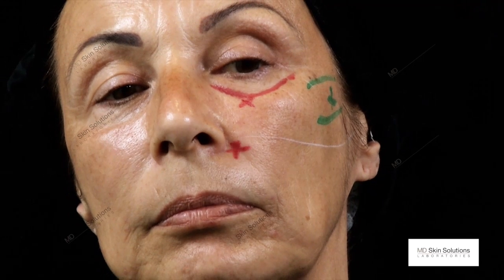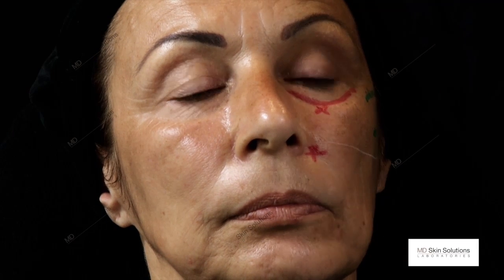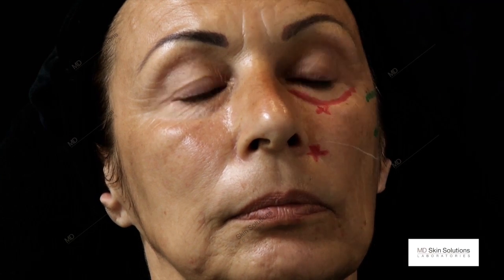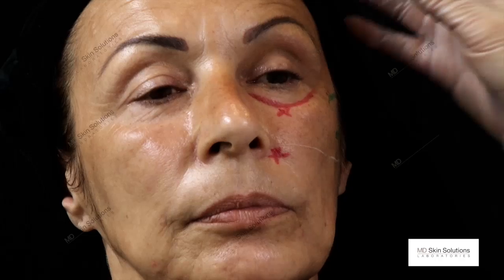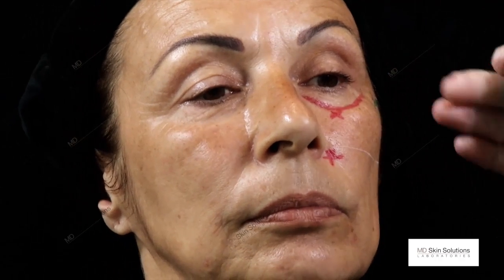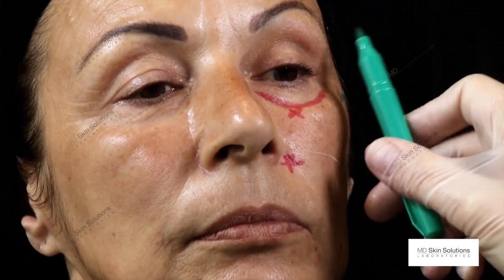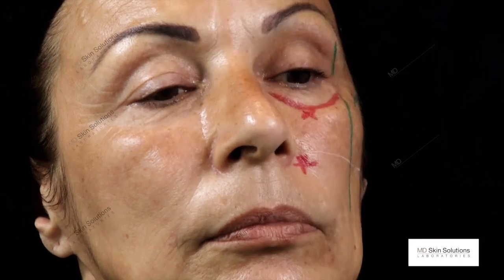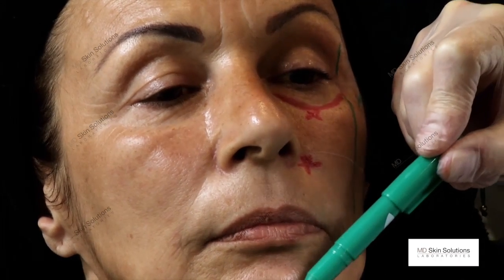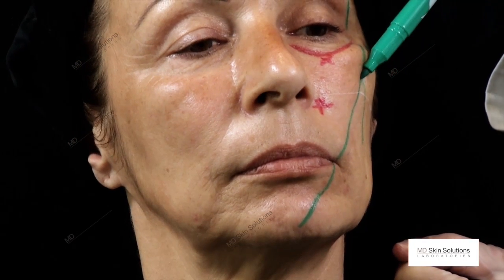The next entry point is the cheek apex point, and I can find it by drawing two lines. The line to find the cheek apex point, the entry point for this injection, is to choose the lateral orbit and a line which goes perpendicularly down here, and the second line is the mid-mentum, corner of the mouth line, and where the two cross.